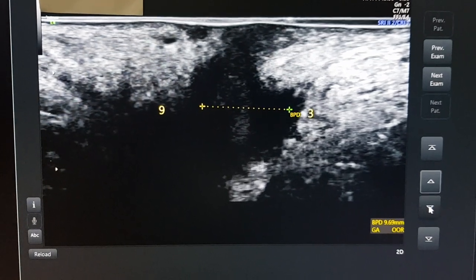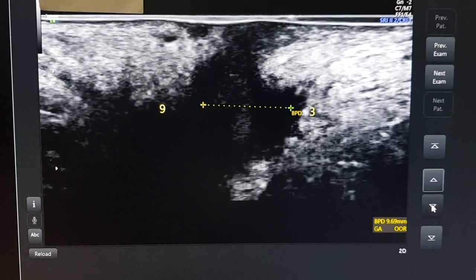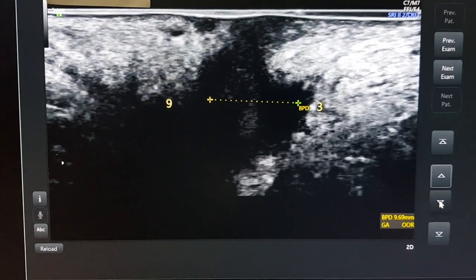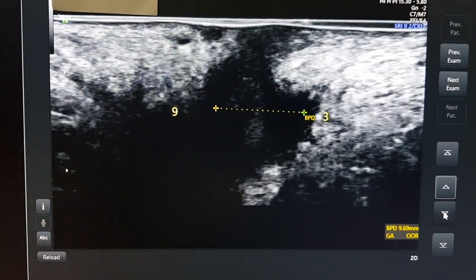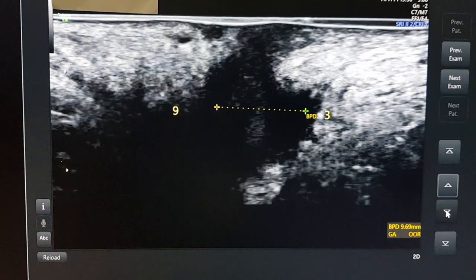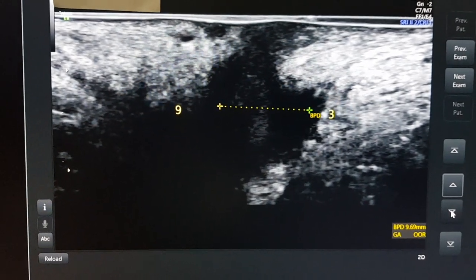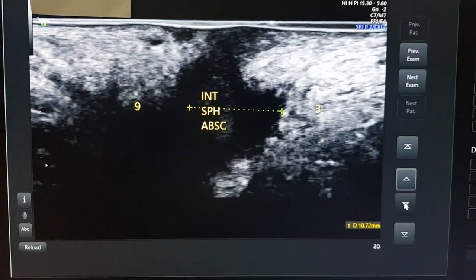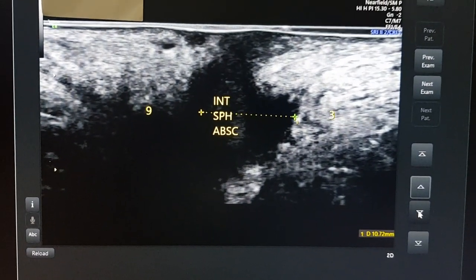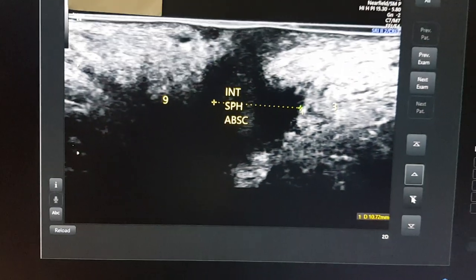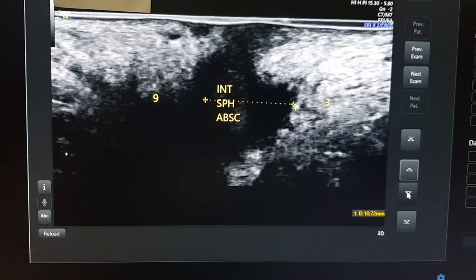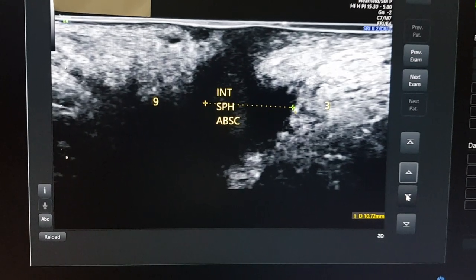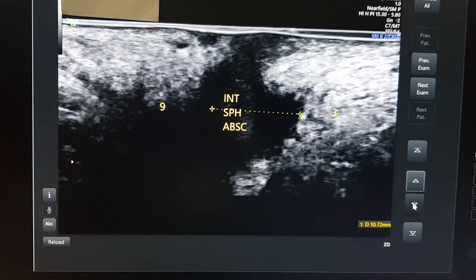Then I turn the probe in a coronal axis and move the probe posterior to the anal canal. You can see 3 o'clock is on the left side and 9 o'clock is on the right side. This is the breadth or left-right dimension of the abscess. We have measured the breadth of the abscess and it is about 10 mm. So the intersphincteric abscess has been measured in the sagittal plane, which gives the length and AP dimension, and in the coronal plane, which gives the breadth — it is a broader, taller abscess.